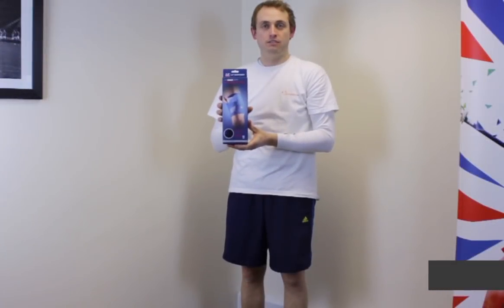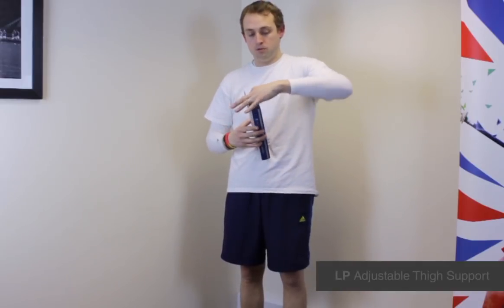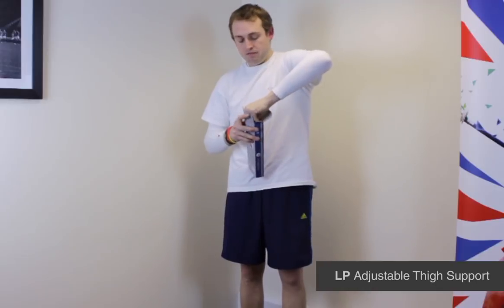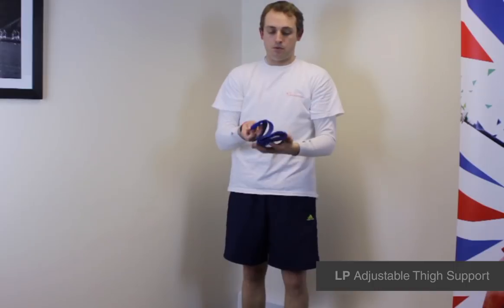I'm Michael Babison, Managing Director of First Aid for Sport, and this is the LP Wraparound Thigh Support. It's a really good value, simple wraparound thigh support.